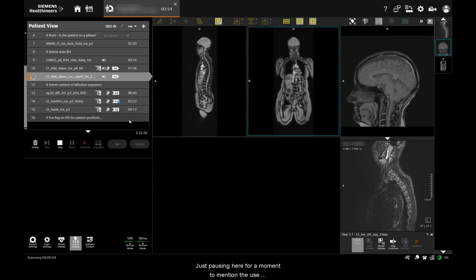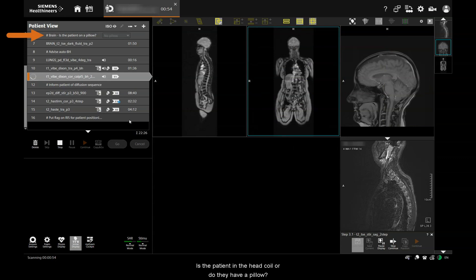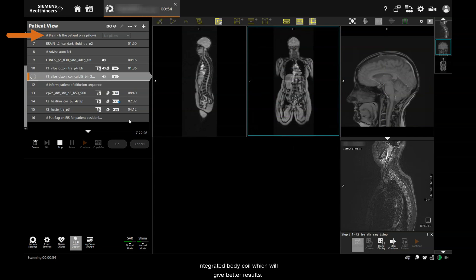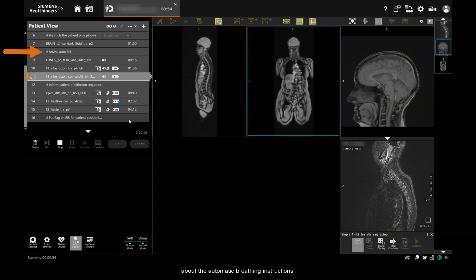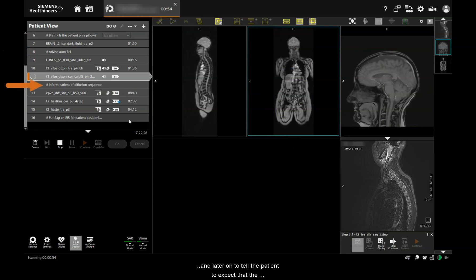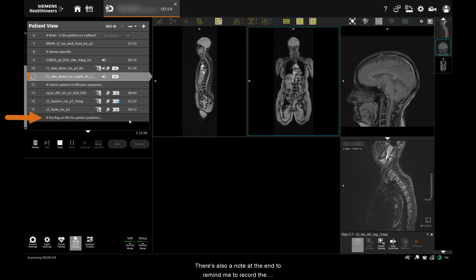I want to mention the use of decision steps and rename pauses as workflow notes. Here I've got a choice: is the patient in the head coil or do they have a pillow? Selecting 'no pillow' loads a sequence using the head coil, whereas if the patient is propped up high on a pillow far away from the coil, we can choose to use the integrated body coil, which will give better results. There's a reminder to tell the patient about the automatic breathing instructions, and later on to tell the patient to expect that the diffusion scans will be very noisy. There's also a note at the end to remind me to record the equipment setup and patient positioning so that the next time the patient comes for a scan we can perform it in the same way — and this is key to maximizing reproducibility.